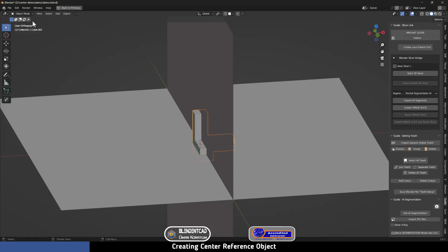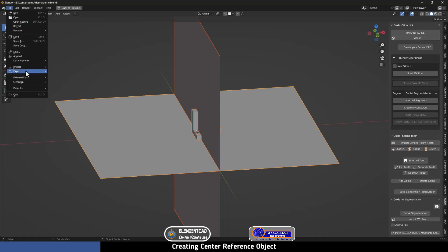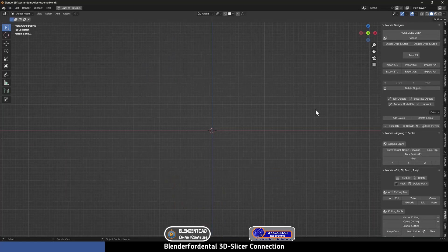Now I'm going to export this object to an STL so I can use it in future cases. I'm going to press A to select all the objects, then File, Export, STL, and save it in the location that you want.